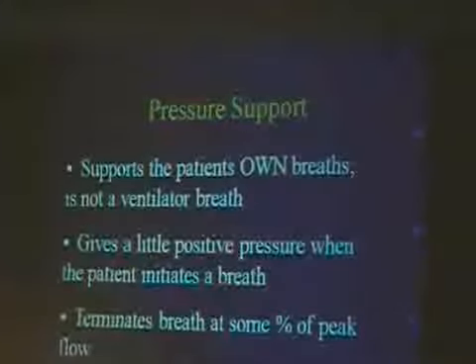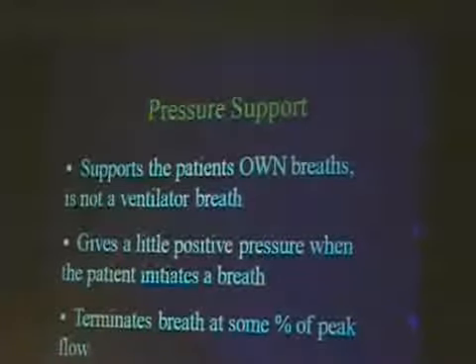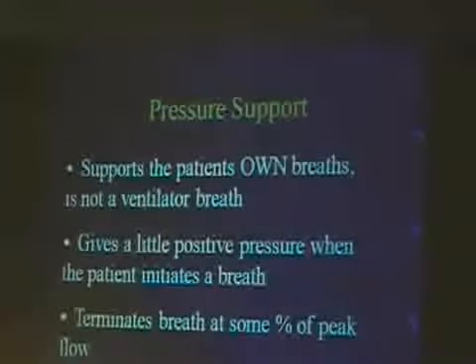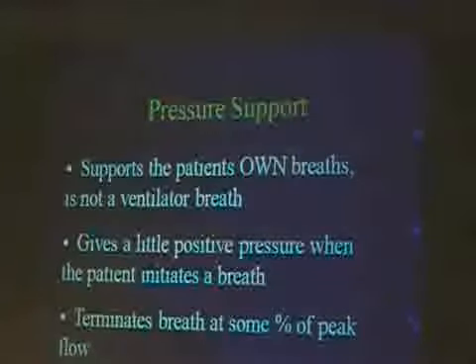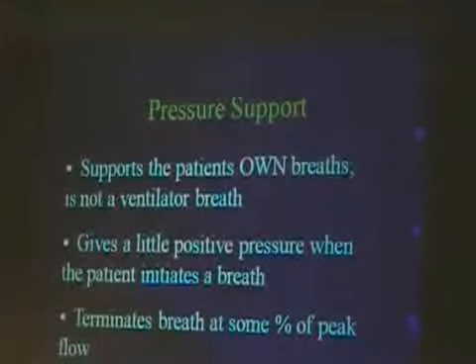All right, so in the remaining few minutes, I just want to talk a little bit about some of the other things that have come up from time to time. Pressure support is a patient breath and only a patient breath. All right, it is not initiated by the ventilator, it is only initiated by the patient. If the patient doesn't breathe, there is no pressure support breath. All right, it supports the baby's own breaths, it's not a ventilator breath.